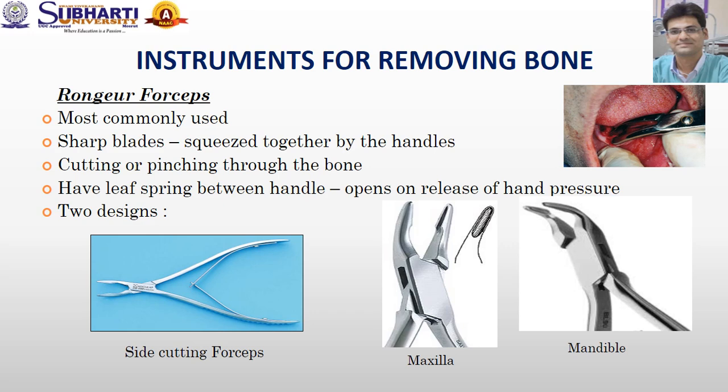When removing bony pieces or sharp edges, we should remove them in smaller bits over multiple times, not a single large piece of bone at the same time.